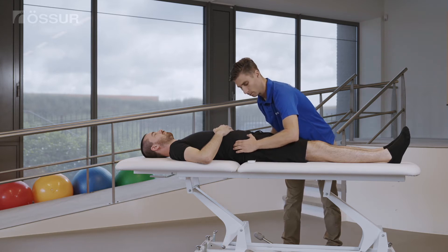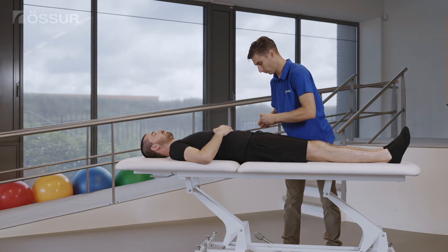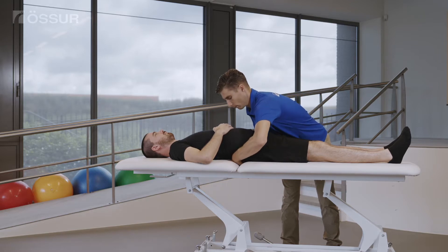To determine the correct panel size, take the circumference of the trunk at a level midway between the lowest ribs and the upper iliac crest.